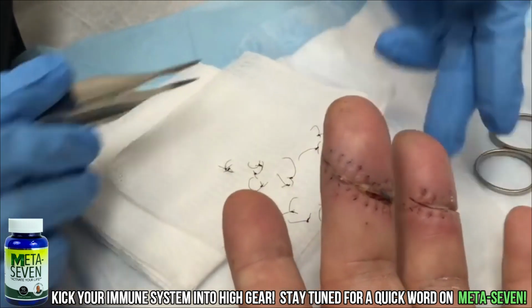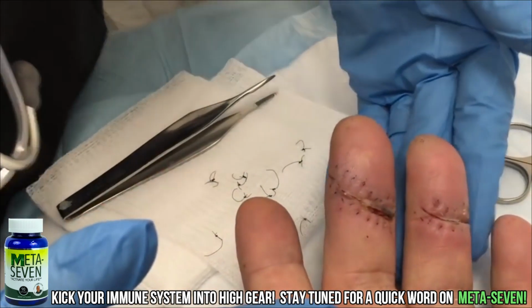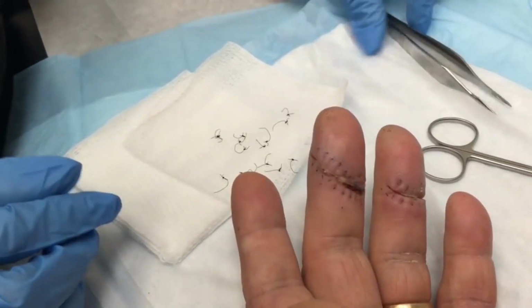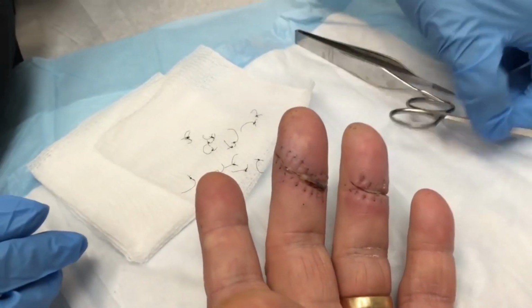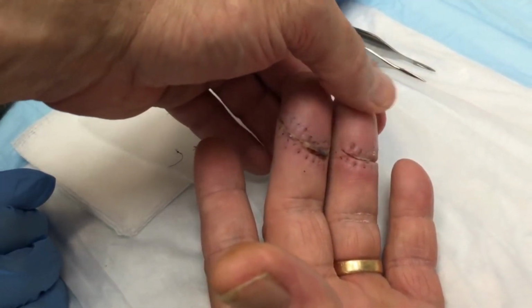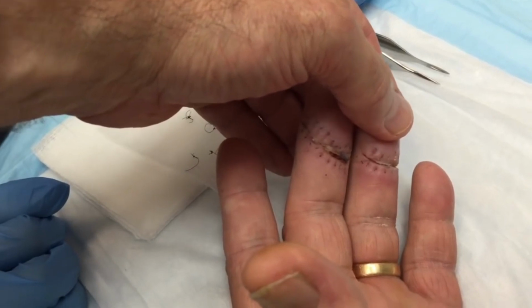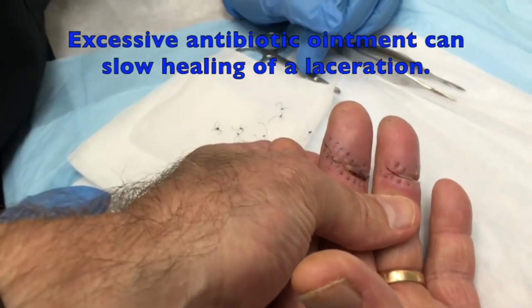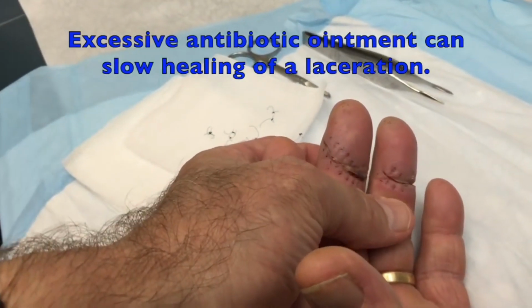You did good. Did you put any Neosporin or any ointments on that? Triple antibiotic, 3 times a day. Wash with antibacterial. That could be part of the reason why this one didn't heal very well. Why? Well, sometimes when you put ointment on it like that, it works its way down into the wound and it prevents healing. But we're going to go ahead and steri-strip this one for you.